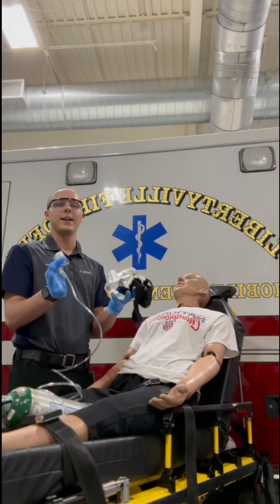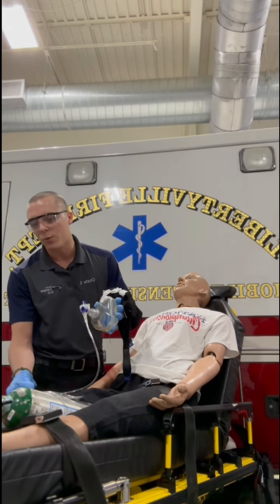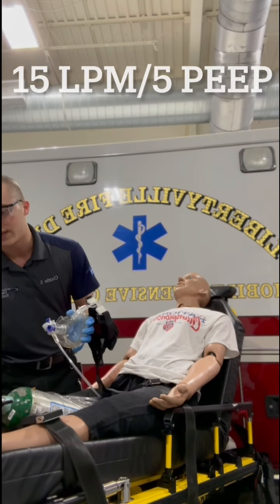So this is going to be the mask. There's a connector that fits directly into the mask, and then the other side of the tubing is going to go into your oxygen source. All of the masks are going to have an indicator on the tubing that shows you what to titrate for the specific PEEP. So we're going to start off at 5 PEEP, which is going to be for our mask, 15 liters per minute. Place the mask, just the mask, on the patient's face.